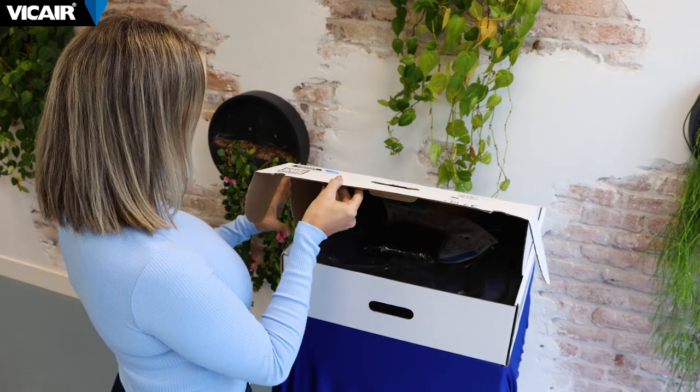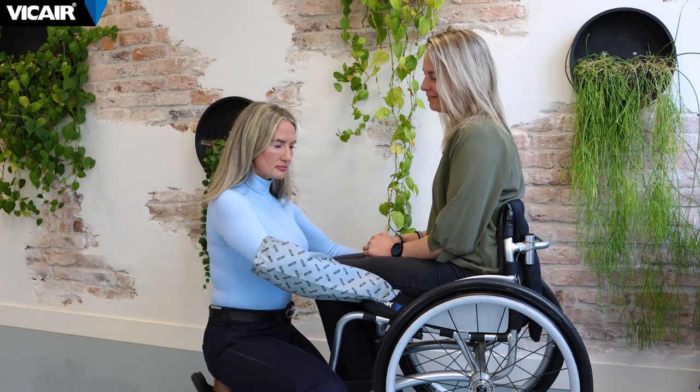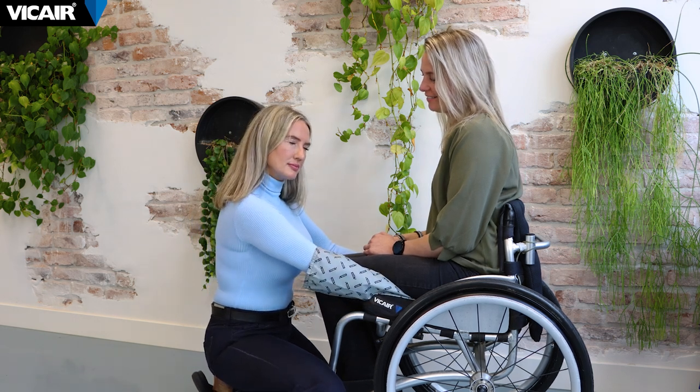It is crucial to check for bottoming out when first using any new wheelchair cushion and thereafter on a regular basis. We suggest checking every three months, or earlier if there is a change in the client's condition.